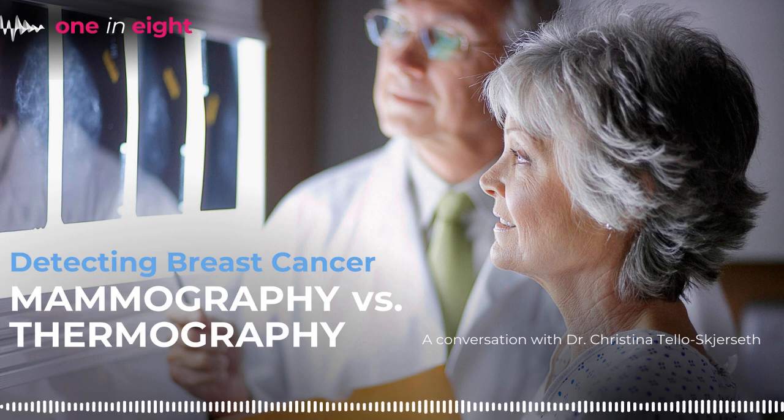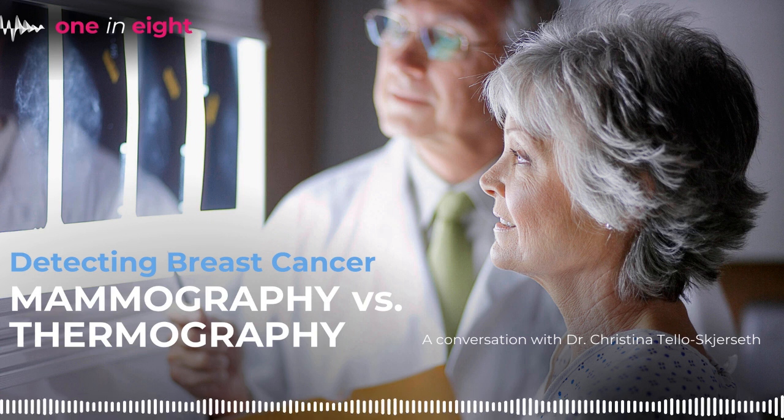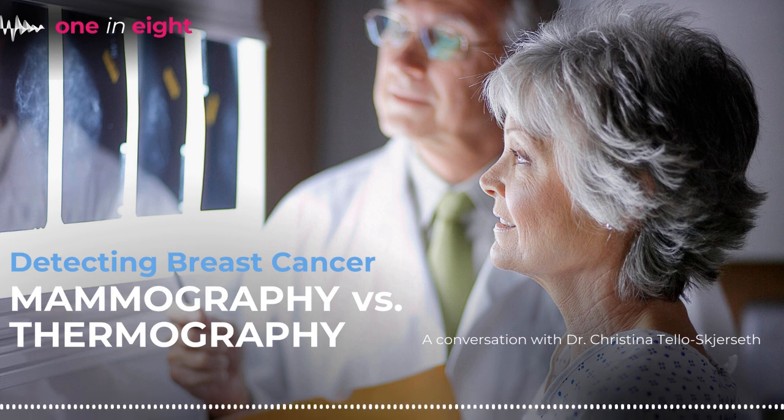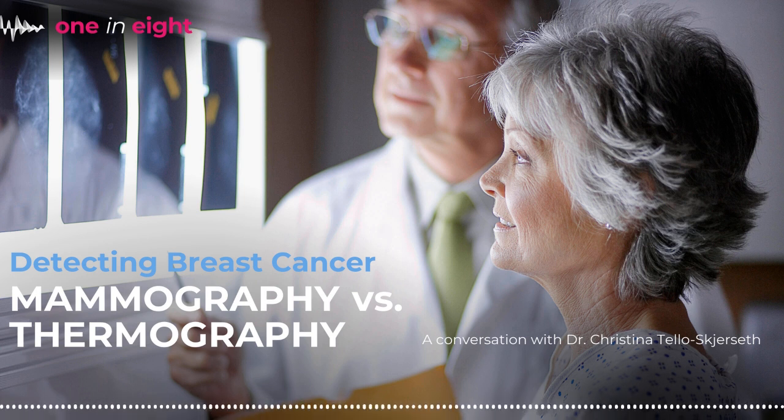I think some people just feel better with getting some kind of exam that is pain-free and doesn't have radiation. And I mean, that's fine for some people, but you need to know that it's not actually detecting cancer. And just because you get a negative thermogram does not mean you don't have cancer. And you really should be using a modality like mammography, which has all the data behind it, and that's federally regulated so that things are done consistently and accurately.